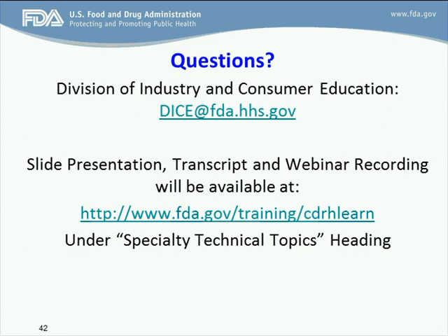In Section 9, it discusses disinfection and sterilization, and in the second paragraph, there's a statement, validation data should be generated in FDA-cleared sterilizers and with FDA-cleared sterilization accessories, e.g. biological indicators, physical chemical sterilization process indicators, sterilization wraps. This typically is done when validating sterilizers or sterilization processes, and when validating reusable medical devices, specifically Class 2 devices, typically the biological indicators used for the validation process are not FDA cleared, not all of them. Most healthcare FDA-cleared BIs are self-contained. So when trying to validate a complex device like an endoscope or some other lumen-type device, inoculated threads or even direct inoculum is used. So this statement appears that those types of BIs cannot be used in the validation process anymore.